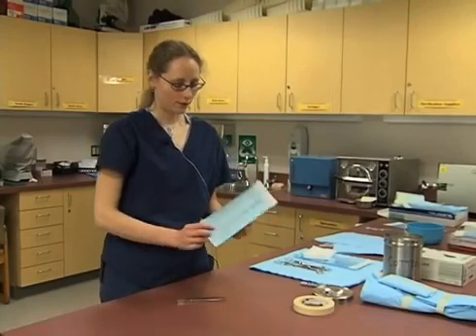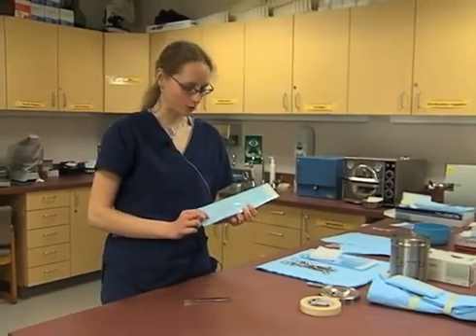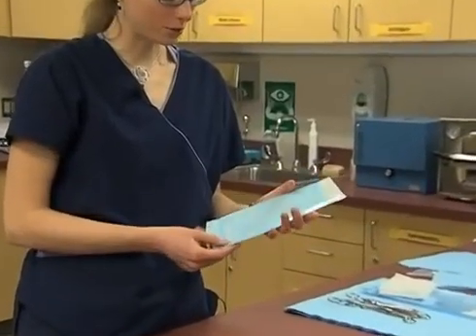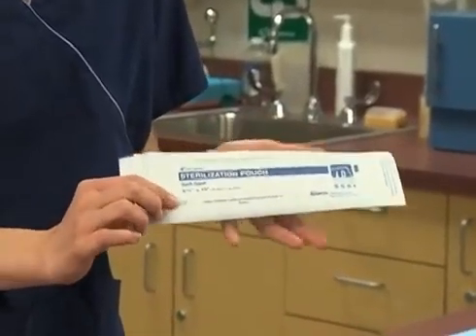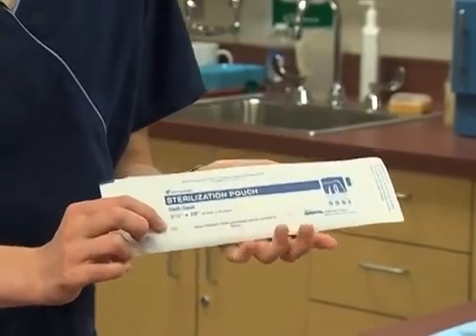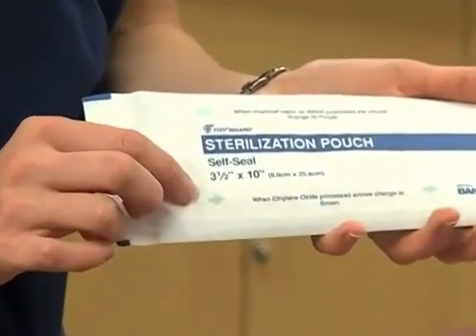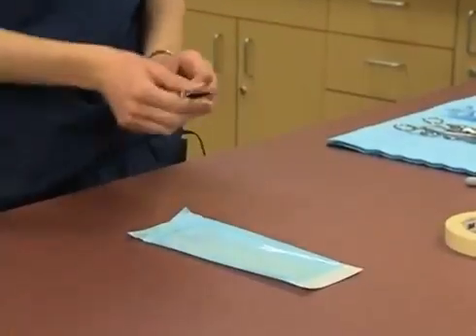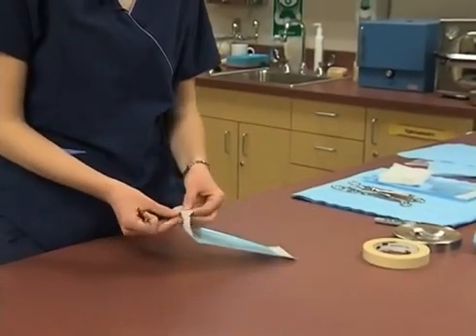A common way that we'll prepare instruments for the autoclave is to put them in a pouch. These sterilization pouches are already ready to go with an indicator on the package itself, so we do not need to put an indicator inside them. The arrows on the outside of the sterilization pouch will change color when they've been sterilized properly.